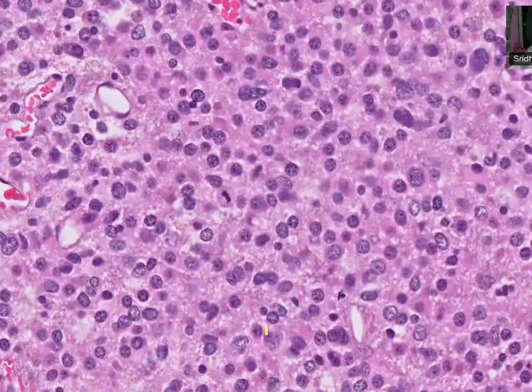So there is a geographical distribution. Previously, there was geographical distribution of tumor cells. In this picture, there are enlarged pleomorphic astrocytes. We don't know whether astro or not, because they're not perfectly round glial cells. Likely to be an astrocyte with scanty to absent cytoplasm, sir, with fine granular chromatin. And also in this picture, I can see mitotic figures.